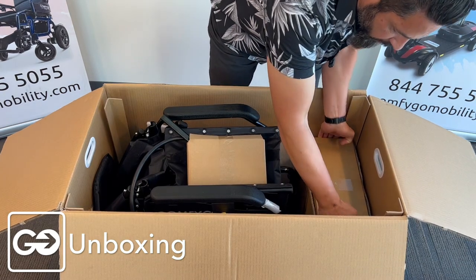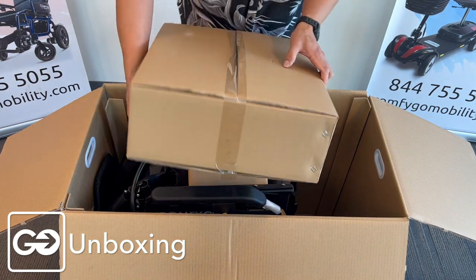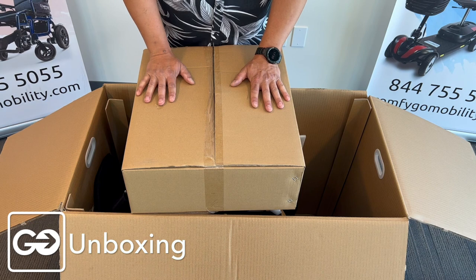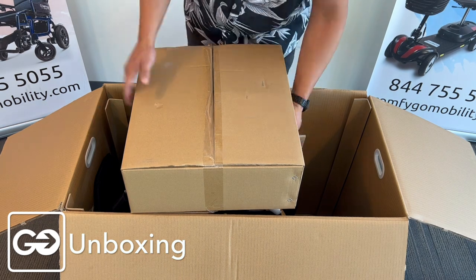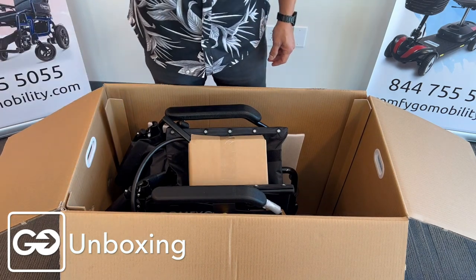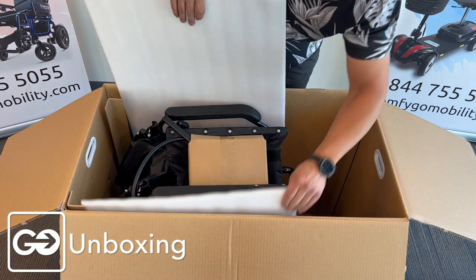This box here that comes in the box is going to be your leg rest. We're going to open that up in a little bit and I'll show you what those leg rests look like and how to assemble them into your chair. We do have a backrest here that we need to pull out — this is the part of the chair that goes on top where the headrest is at.